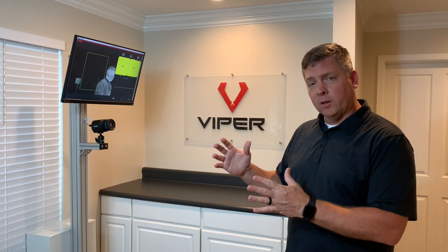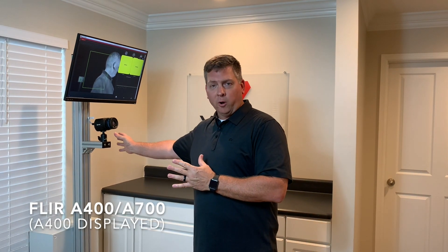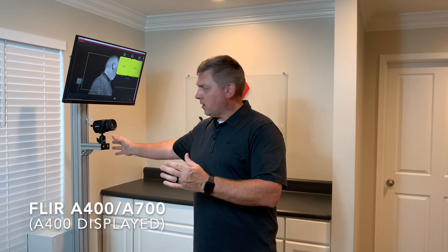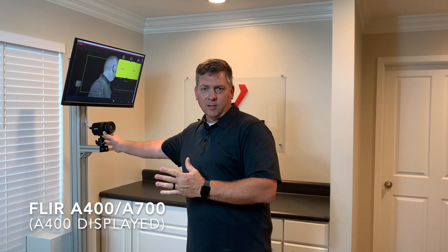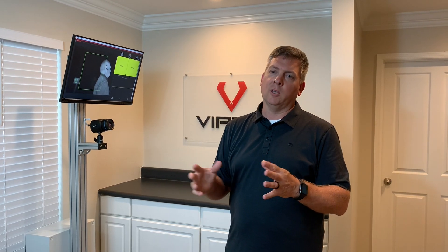One of the neat features of this is we're using the FLIR A400 camera. We can use the A700 as well. These are FDA 510K compliant cameras by FLIR. They represent really the latest and greatest in infrared technology — high-resolution systems that measure in highly accurate means for being able to see the best temperature possible.